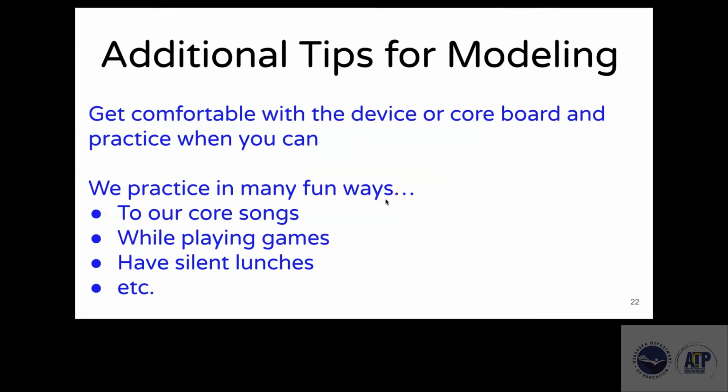Here's some additional tips for modeling. The number one thing that I try and do with our staff is really give them time to get comfortable with the device or core board and practice as much as they can. And we have some really fun ways that we do that in our district. We will practice through core songs. So we have some core-based songs that we use with our students, but then during professional development, or if we have even 10 minutes at the beginning of the day, we'll play a core song and we will actually then practice singing that song on the board or device, just to help gain that comfort level and where things are.